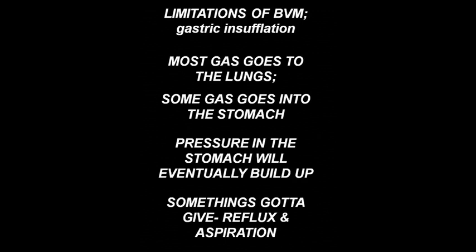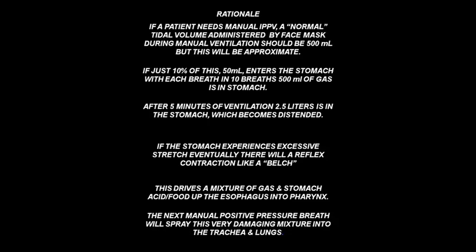Most gas goes into the lungs during manual ventilation, but some gas inevitably goes into the stomach. After multiple ventilations, the pressure in the stomach will eventually build up, and eventually, as the stomach fills with gas, something has got to give, and the high pressure in the stomach may cause reflux and aspiration. The rationale for intubation in this situation: if a patient needs manual positive pressure ventilation, a normal tidal volume administered by face mask during ventilation should be approximately 500 mL, but this of course will be approximate.